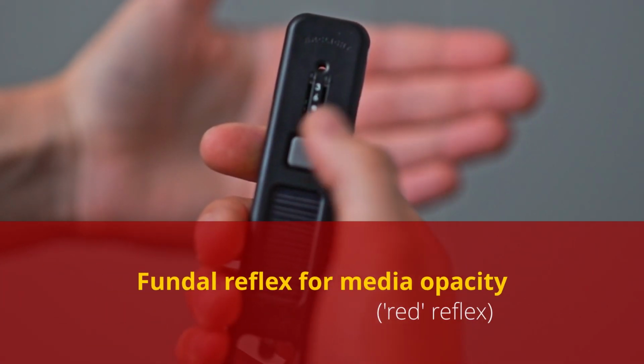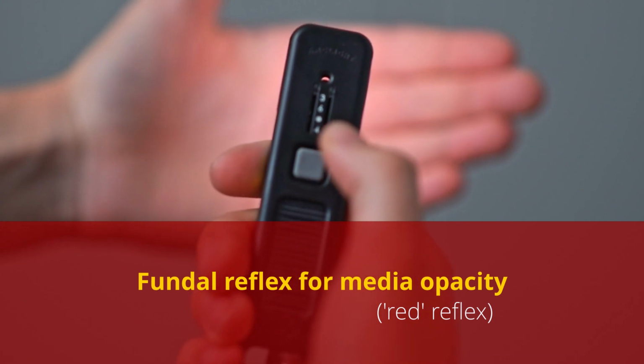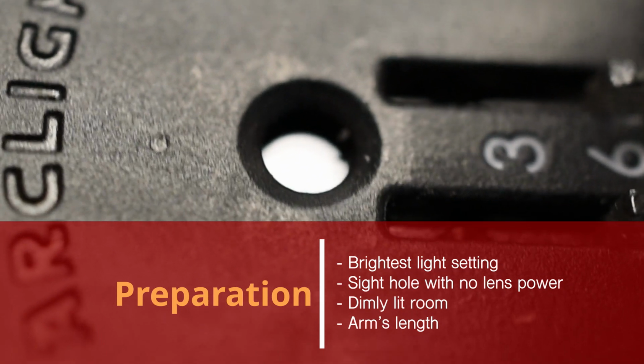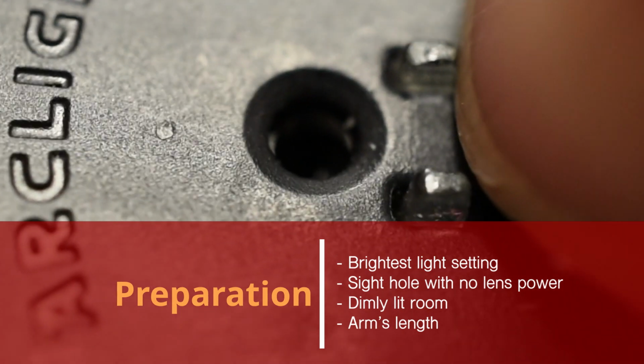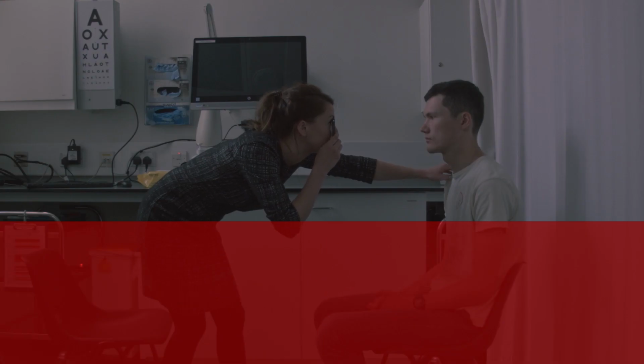The next step is to perform the fundal reflex test to assess for media opacity. Set the arc light by clicking the button 3 times for the brightest light, and then move the lens rack to the top so there's no lens power. With the arc light prepared, dim the lights in the room, and at arm's length, look through the sight hole.